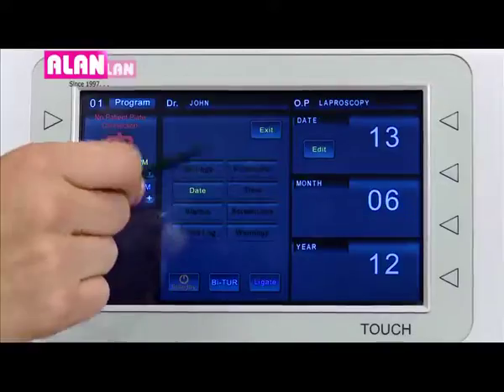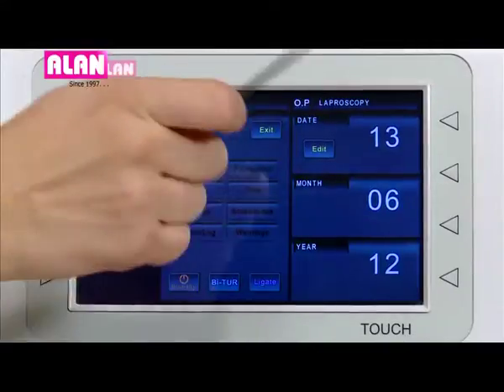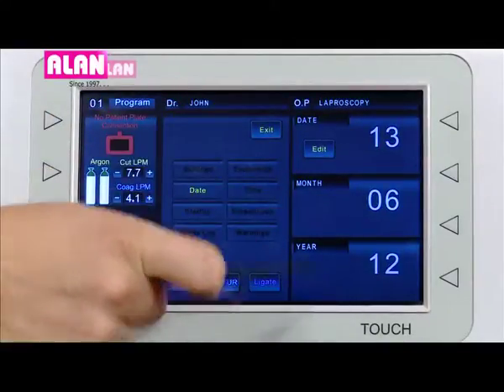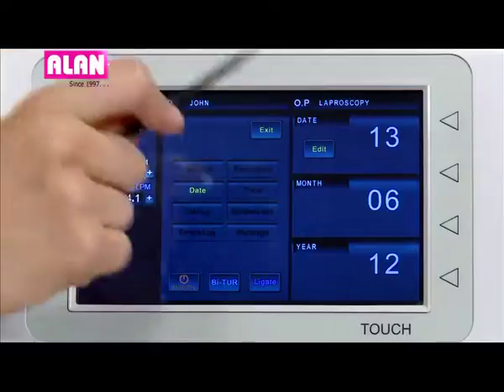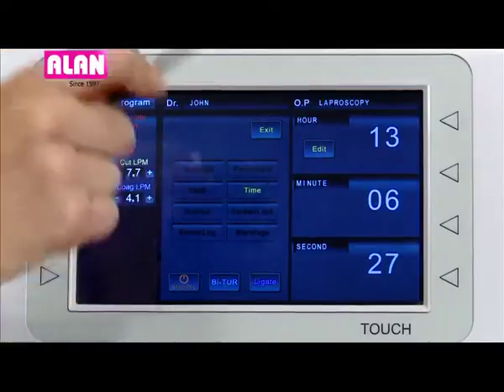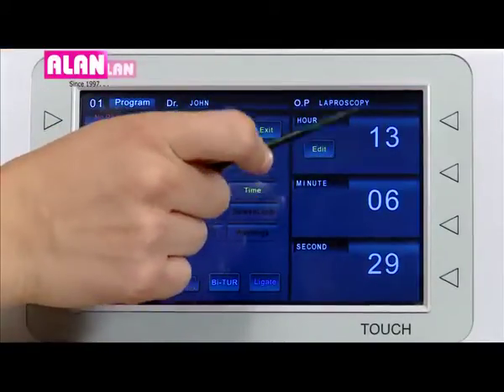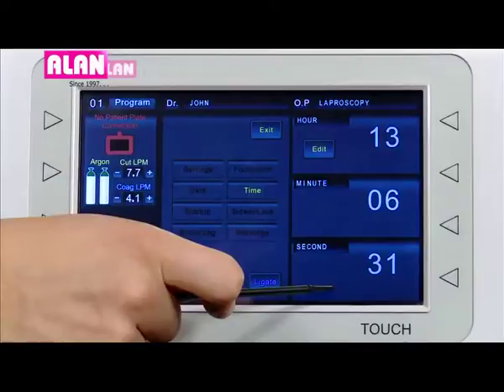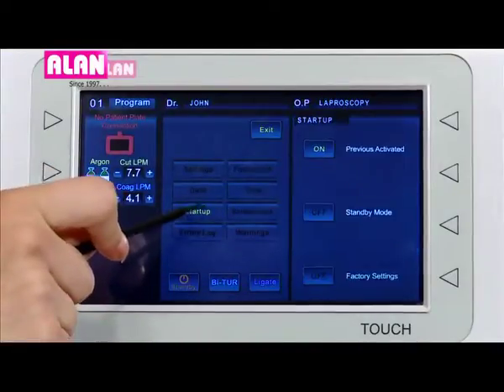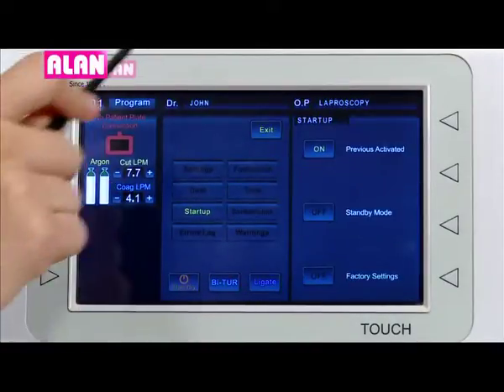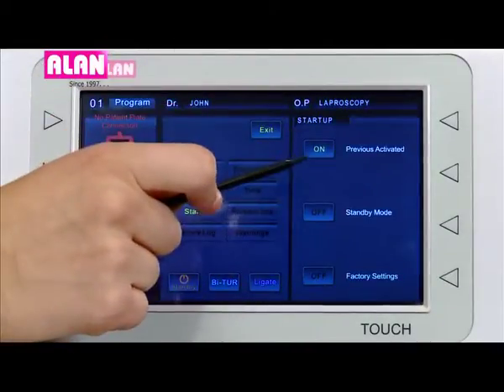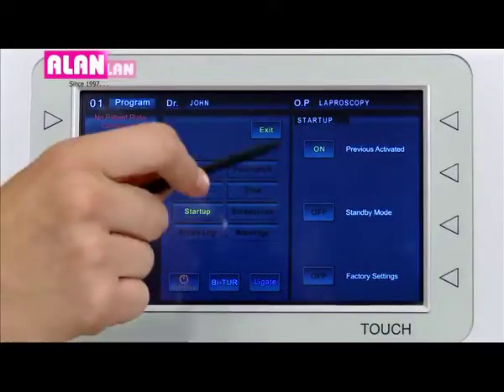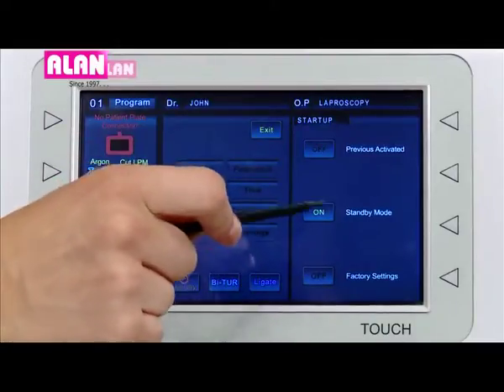In date, the current date is being shown. In time, the current time is being displayed. In the startup section there are 3 options: previous activated, standby mode, and factory settings.